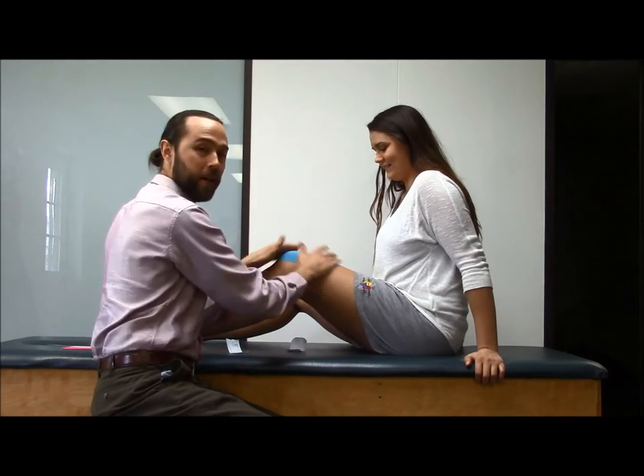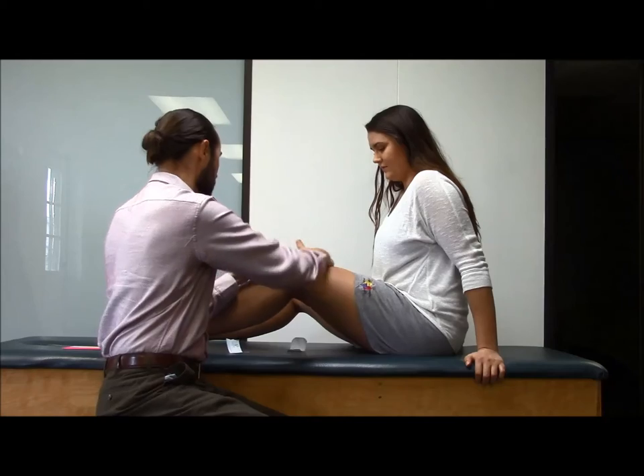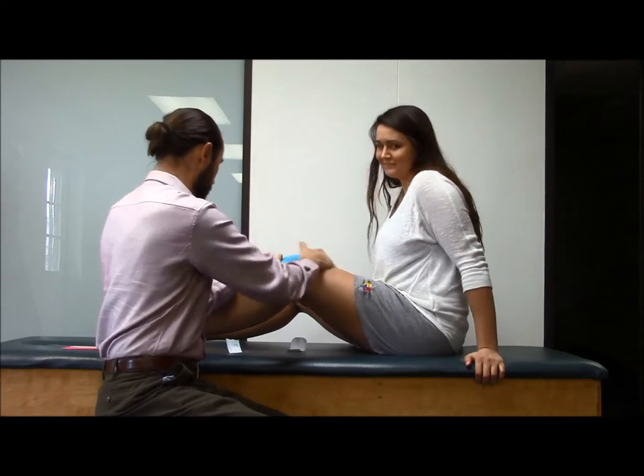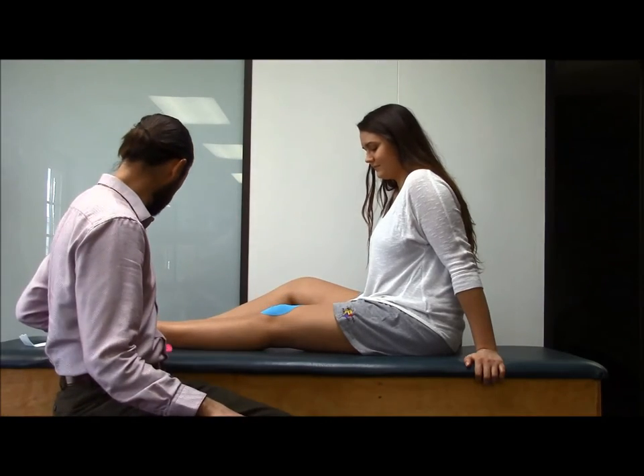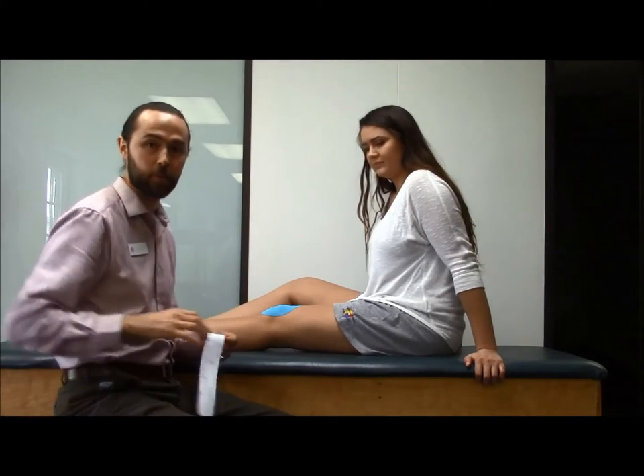With all K-Tape you rub it in to activate the adhesive — so I'm not just rubbing her leg for the fun of it. That will help support her kneecap. If she's out doing some active type stuff and needs a little extra support, that will help.